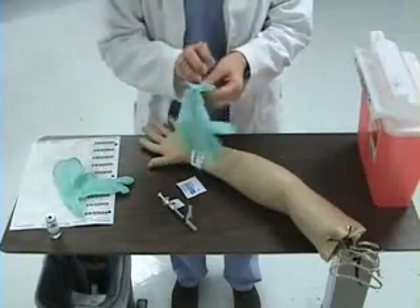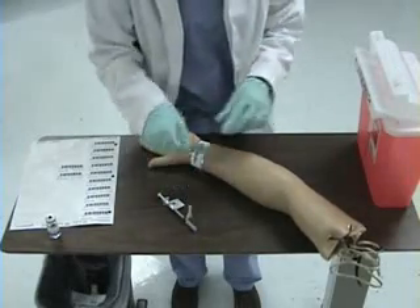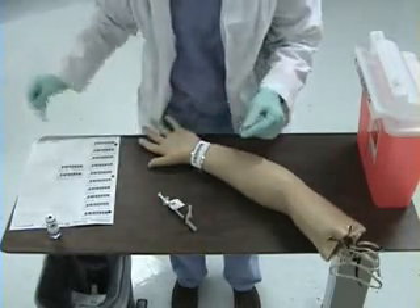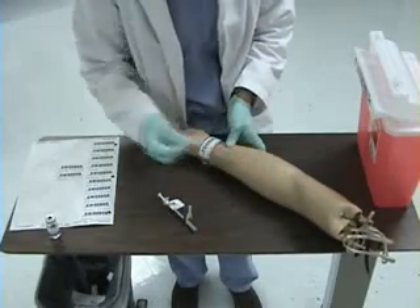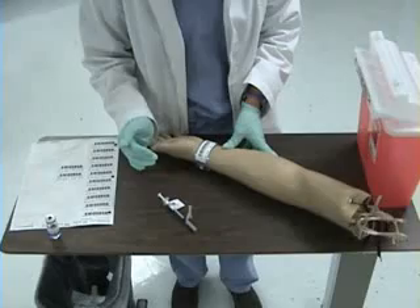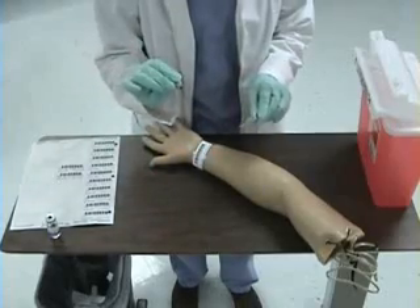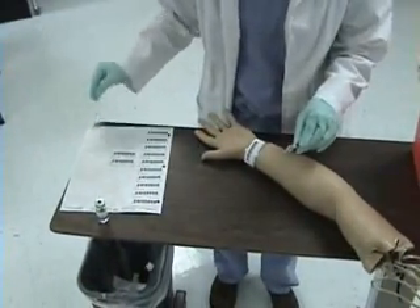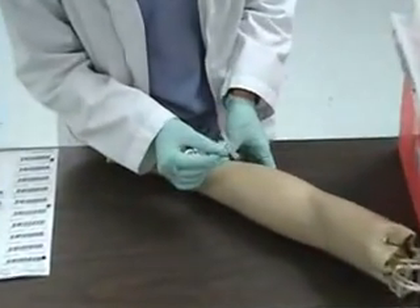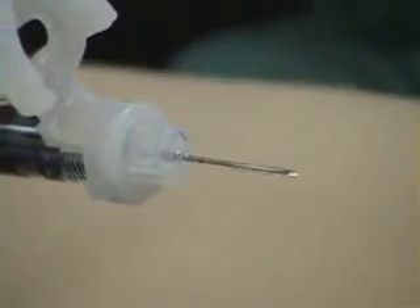At this point, I'm going to put on my gloves for administration. I will cleanse the area with an alcohol prep and allow the area to dry. I will not be fanning or blowing on the area to dry the skin. I am going to uncap my syringe and throw my cap into the garbage.